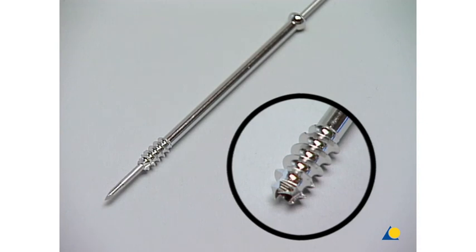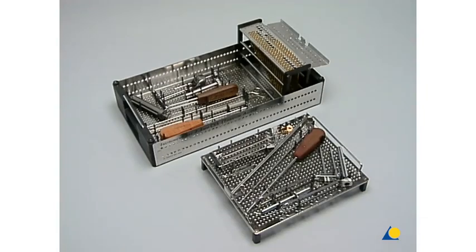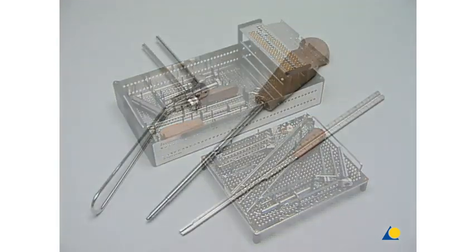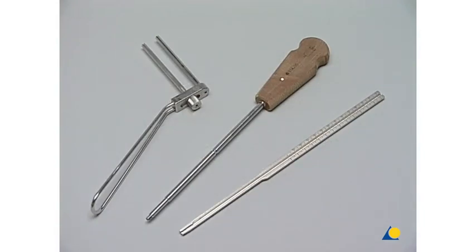Instruments and implants are stored in a special tray. For our exercise, we basically need only these three instruments: a parallel wire guide where one sleeve is adjustable, a cannulated screwdriver, and the direct measuring device for wires from 2 to 2.8 millimeters.